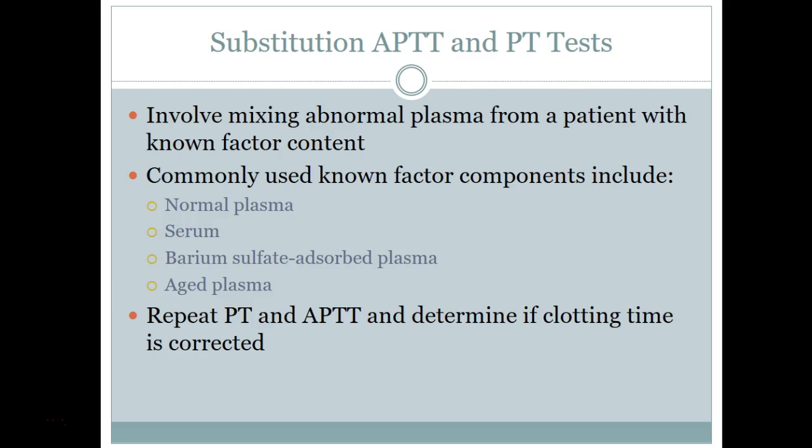So we'll start with the mixing studies. These get a little bit tricky or complicated for people to get. I personally love them because I feel like they're like a puzzle. So once you get them, they're a little bit easier. It's just initially understanding them.